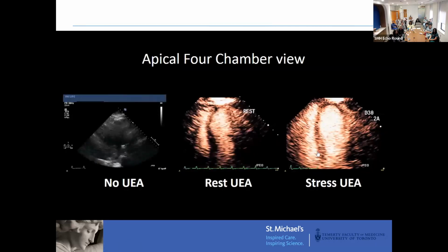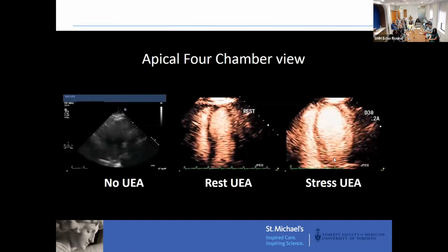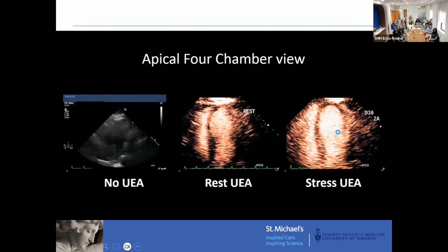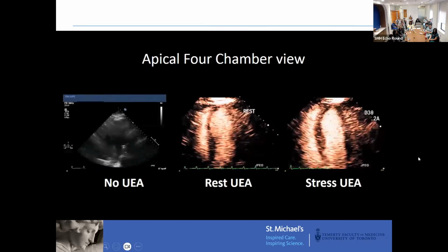If you drop that MI further, they recommend less than 0.3 and sometimes even lower, you can sometimes unveil those segments a little bit better. So playing around with that index can also sometimes help. And these images were all taken within 5 minutes of each other. So you can see that depending on the index, your conclusions can be much more sensitive and accurate.